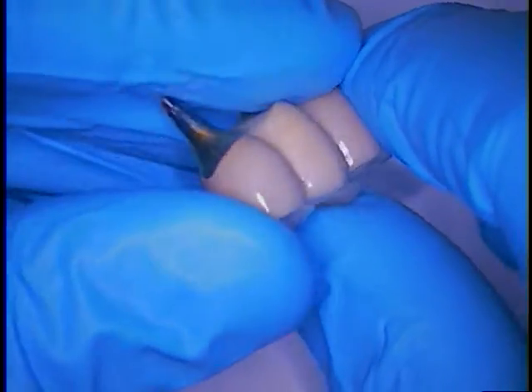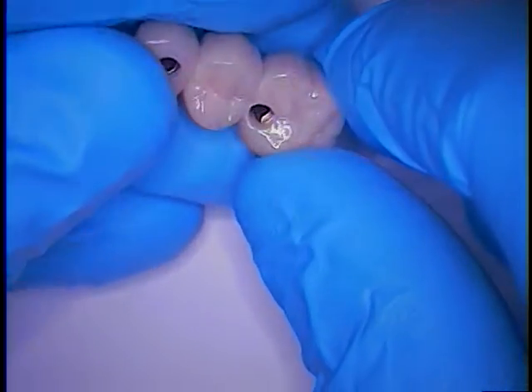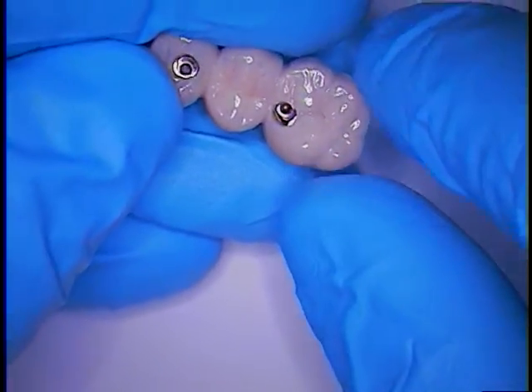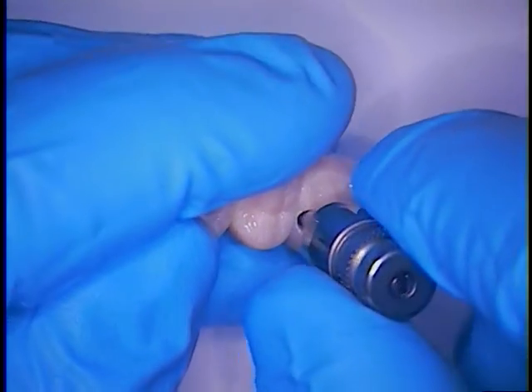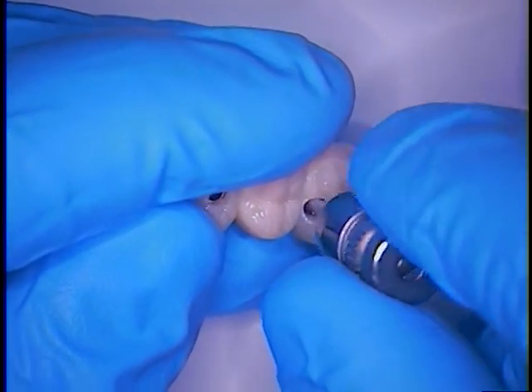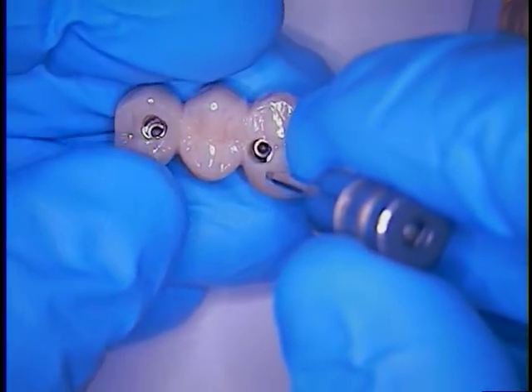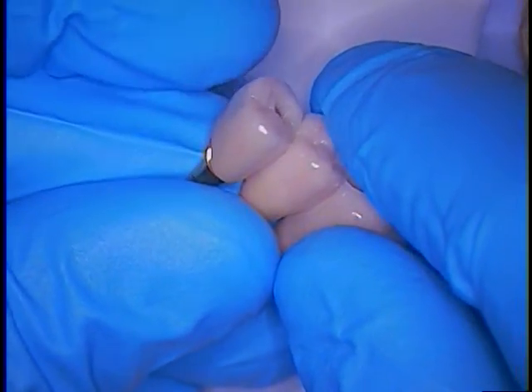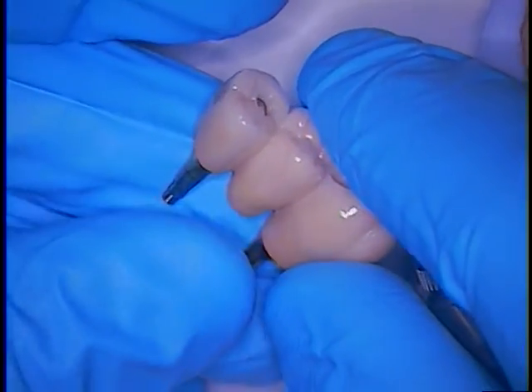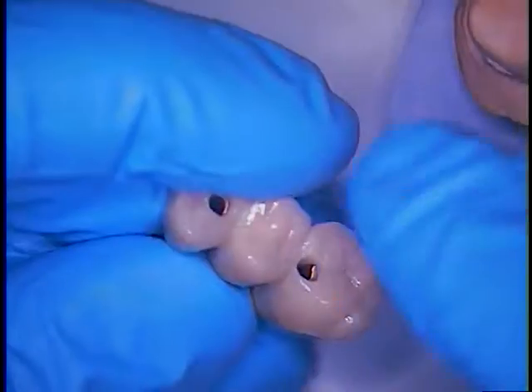We have a little bit of a flat occlusion and a crossbite, so not a lot of deep anatomy here on this case. And for a screw-retained case like this, you have to make sure that your driver seats all the way passively to the screw itself and you've got a little wiggle room in there — so make sure your lab does that. I like my lab that can do this; we now send for parts individually because I do not want to cement the case in the lab. I'd rather do it myself.